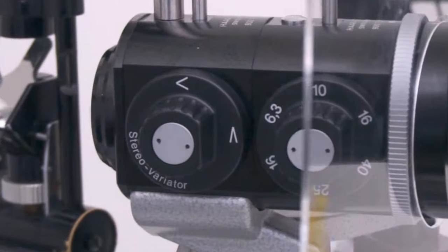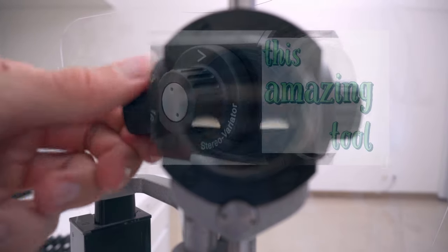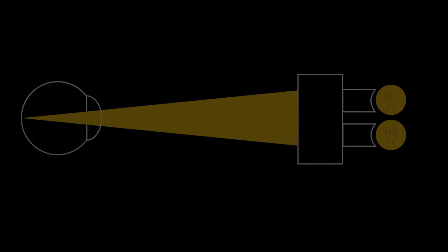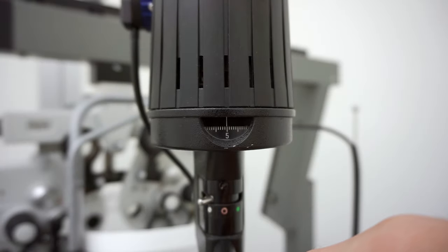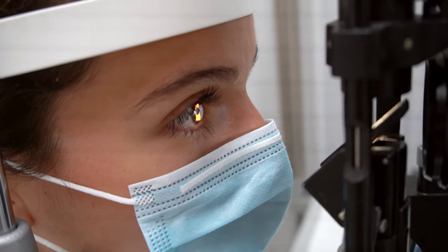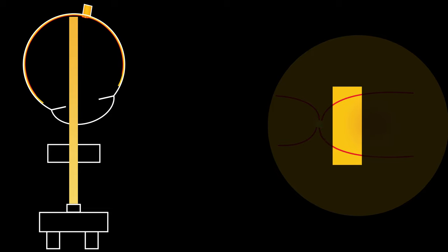If you don't have one, put the tower in the middle. Having a stereo variator actually makes it a lot easier for beginners. If you want to learn more about that amazing tool, go watch my last video. Set your light beam to about 5 mm high and 2 mm wide. Have the patient use the eye that is not being examined to look at your ear. This turns the eye inward so the first thing you see is the optic disc.